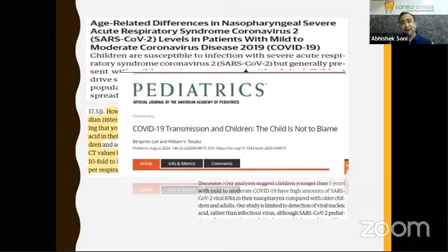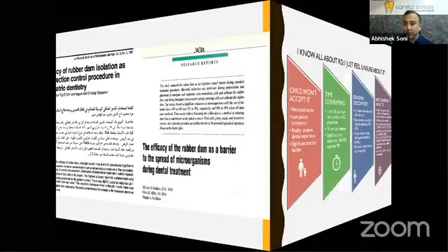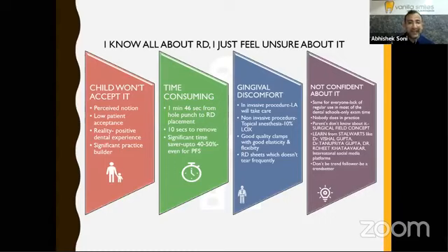A lot of studies have already been done, and the infectivity of the aerosol is what we need to look at once the rubber dam has been placed. There were studies which quoted almost 98.9% bacterial reduction at 1 meter distance once the rubber dam was used in children. So what is actually holding us back from the use of rubber dam? What are the mental blocks that we have? The most important being that probably we are not confident about placing it.